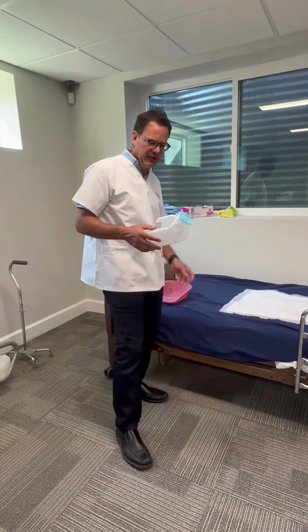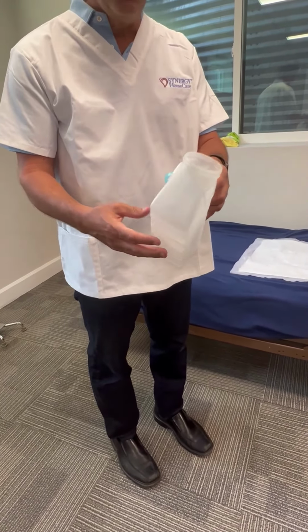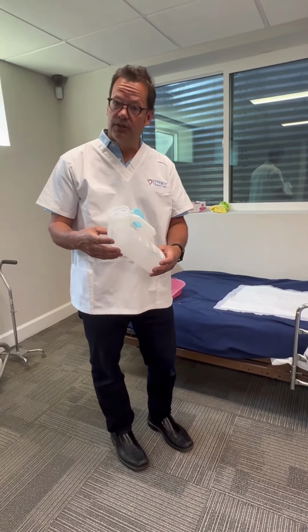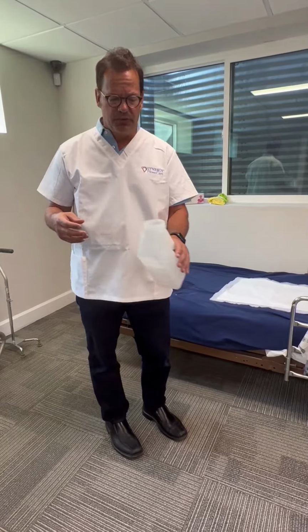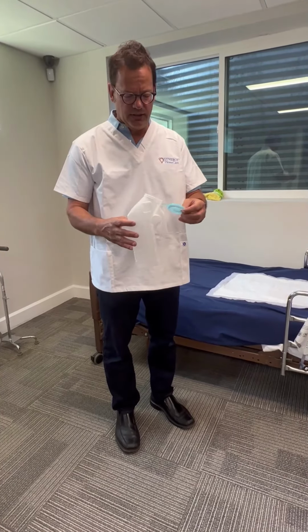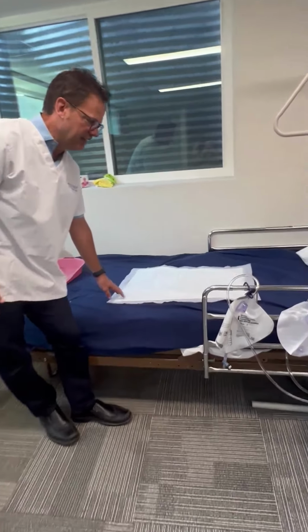This device would be for males, and it is just a device to capture urine while they're in the bed. In some cases we can just hand the client the bottle, and in other cases there is some assistance. So that assistance would be just placing it and collecting the urine from a male and then securing it and disposing of it.